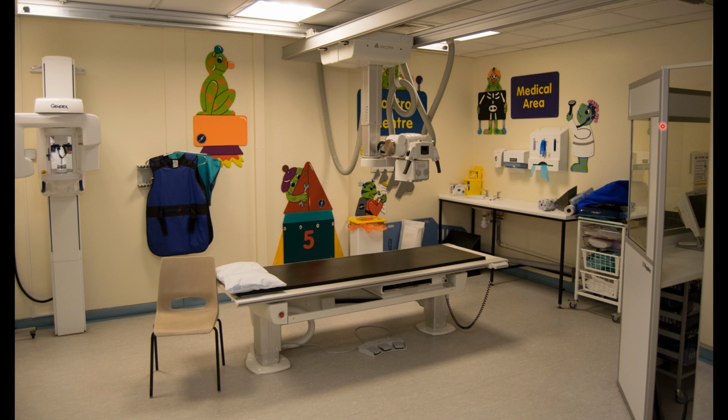This here you can just see off to the side. That is the control panel, and this glass here is not your average glass. This is lead-impregnated glass, so we can see the patient. It's a bit difficult to stand behind somewhere and not see the patient, what they're up to, because if they fall off that table, you're in trouble. Or if they fall over or fall off anywhere, and generally end up injuring themselves, you need to be able to see. And this is lead-impregnated glass, which can stop scatter radiation under up to 150 keV, or kiloelectron volts energy level.